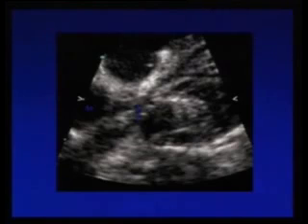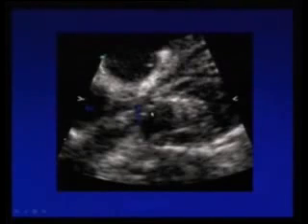Whatever the congenital heart defect, you have to rule out ALCAPA, because with PH physiology, when the pulmonary arteries are hypertensive, with anomalous origin of the left coronary artery you may not get features of decreased coronary blood flow, because blood flow is getting from the pulmonary artery to the coronary artery. As we close the defect, PA pressures fall and the child can go into severe ventricular dysfunction, because now the coronaries are working under low pressure. So whatever congenital echo you are doing, you have to define the coronaries by 2D and color.